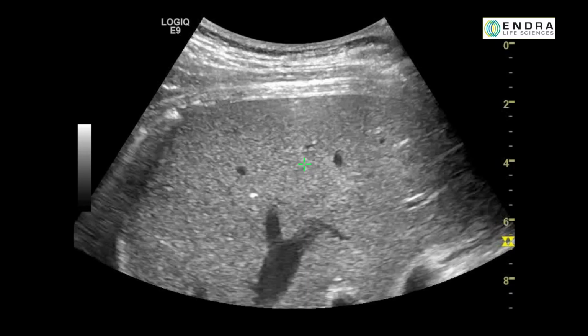Next, measure the distance from the skin surface to the border between the subcutaneous fat and intercostal muscle. TAEUS will utilize the thermoacoustic signal from lean muscle at this location as an internal calibration, as it is not affected by hepatic fat content. Now measure the distance from the skin surface to the surface of the liver capsule. The thermoacoustic signal measured at this location reflects the degree of hepatic fat accumulation.